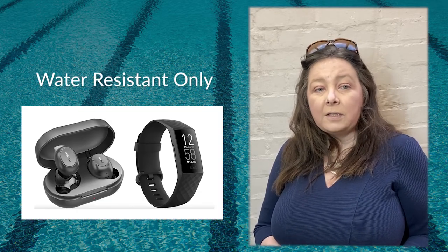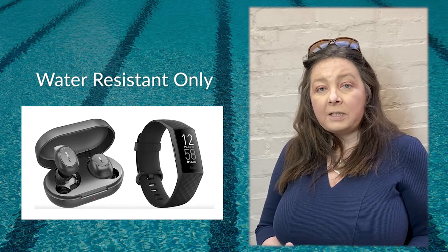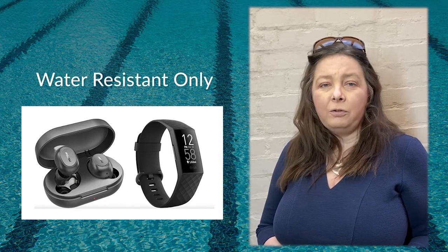Other products which share the IP67 standard include wireless earbuds and fitness watches. These products offer water resistance and they're also not truly waterproof.